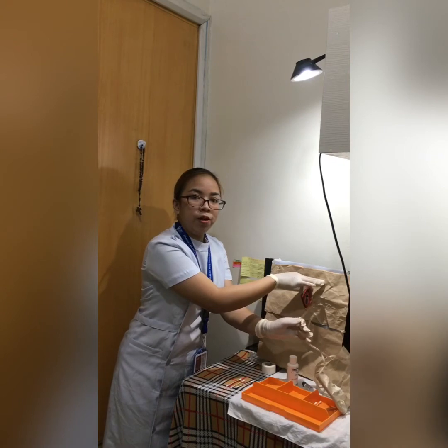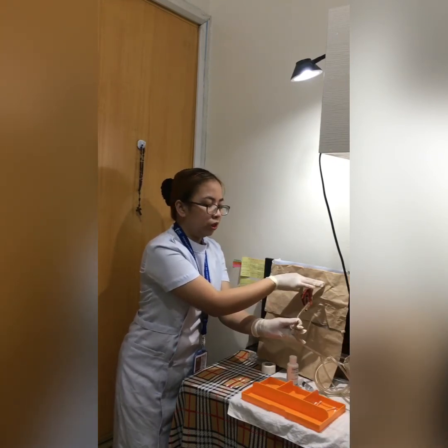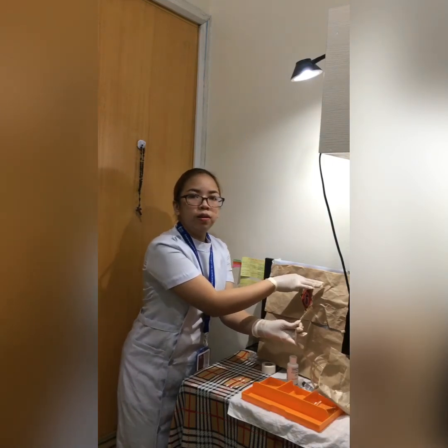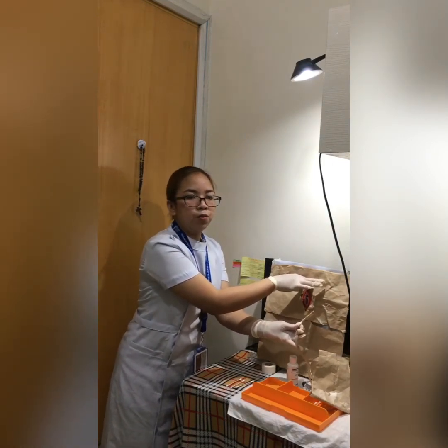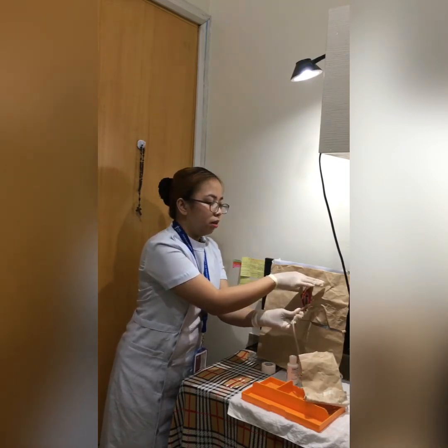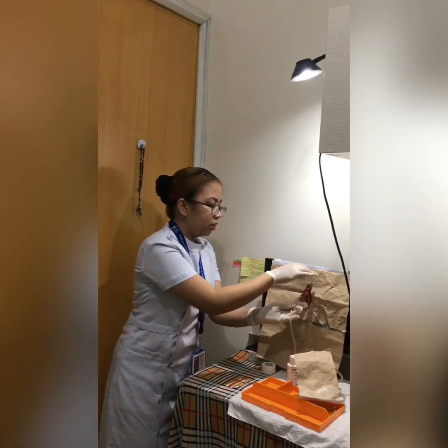Before inserting it, instruct the client to relax and take a deep breath. Inhale, then after the client exhales, you have to insert the catheter.